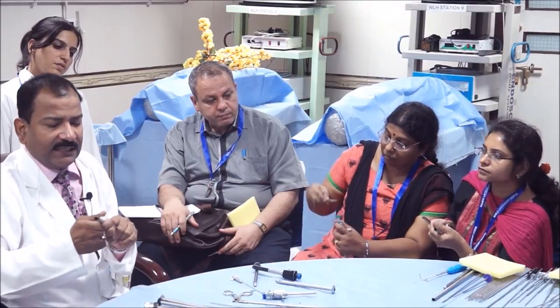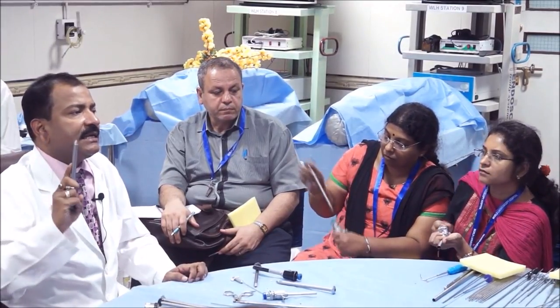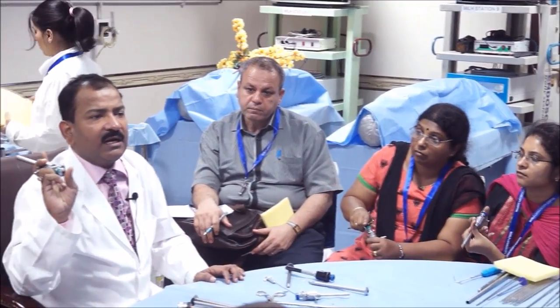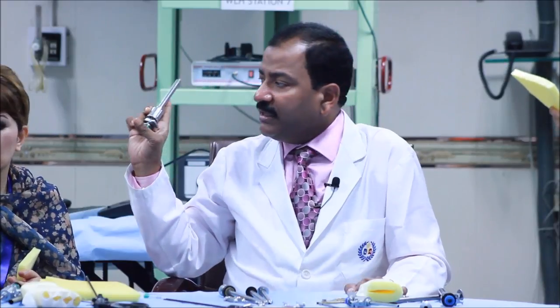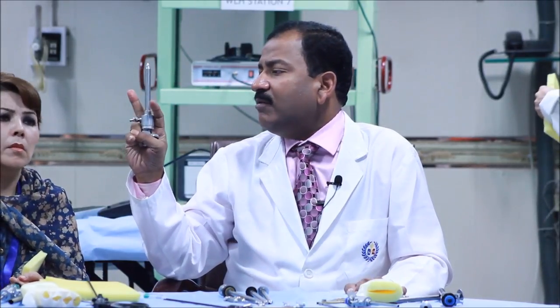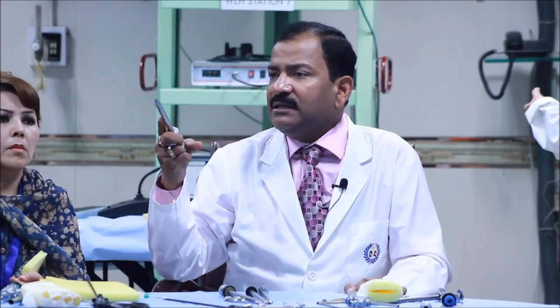And when you are attaching it, you have to hold the trocar and cannula like a pistol. This is the way how to hold the trocar. The head of the trocar should rest over the thenar eminence. The middle finger should wrap around the air inlet of the cannula. And the index finger should be pointed towards the sharp end.